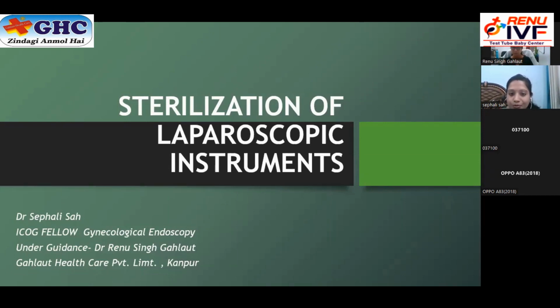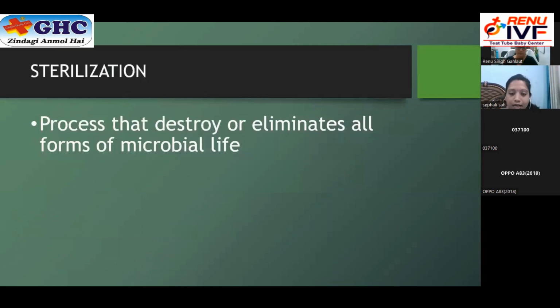Today I am here to present one of the most important topics of our surgical field, that is sterilization of laparoscopic instruments. In this topic, I will tell you about the ways of sterilization, how to sterilize the instruments in a proper manner, and up to what time you can use them. First of all, I will start with the definition. What is sterilization? It destroys and eliminates all forms of microbial life.